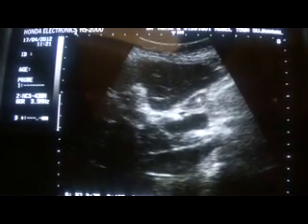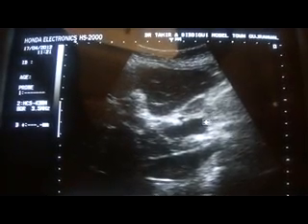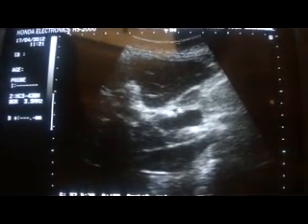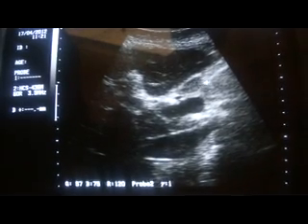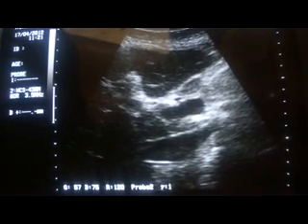Concentrate on this area. It keeps its shape. I have magnified to make it more clear how a lymph node will appear at the region of porta hepatis. This is the lymph node — well-demarcated and hypoechoic. This is the hepatic artery. This is the portal vein. This is the IVC.